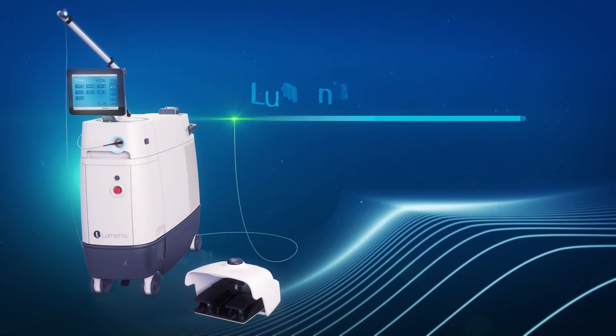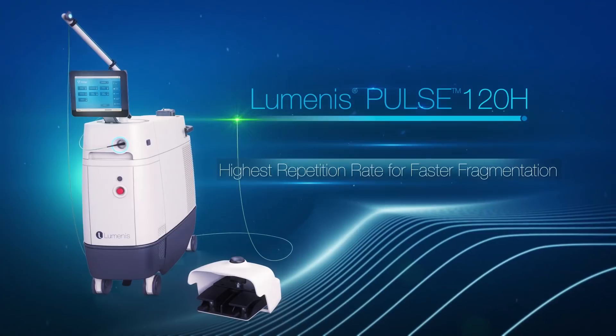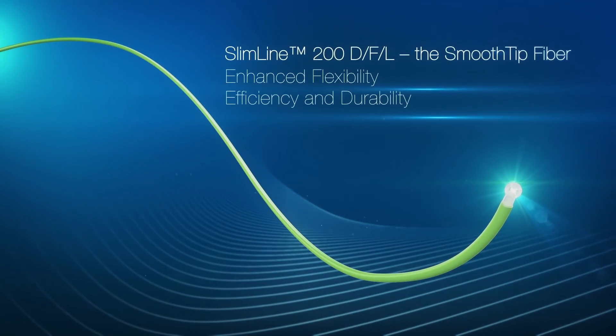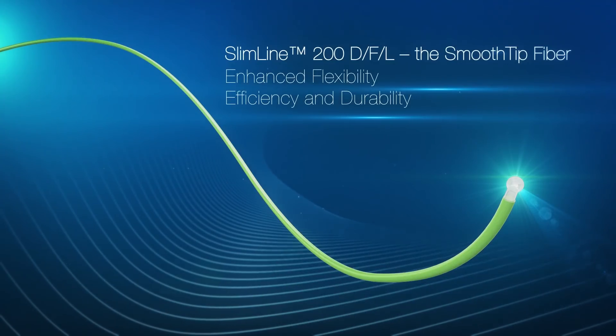The Lumenis Pulse 120H laser system and the Slimline 200 DFL fiber are two essential tools designed and developed for superior stone dusting performance.